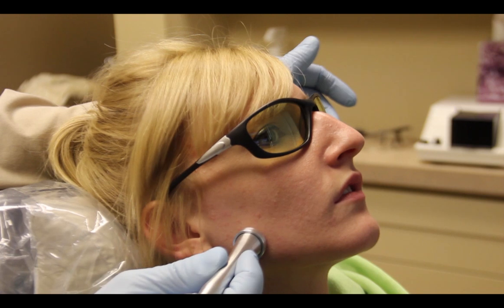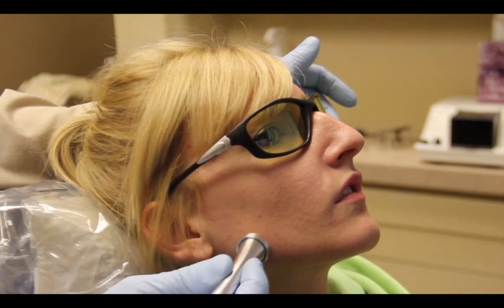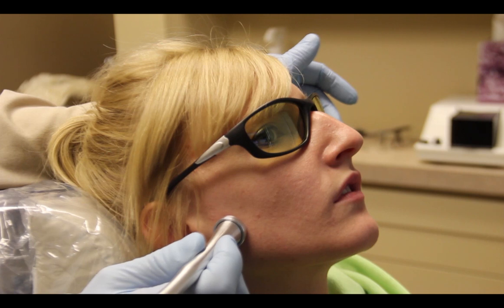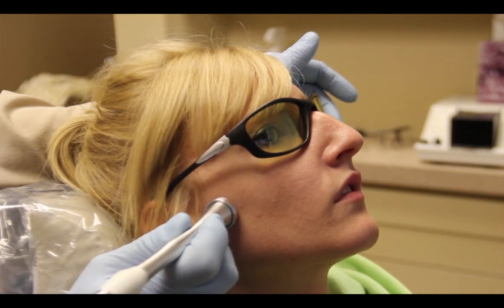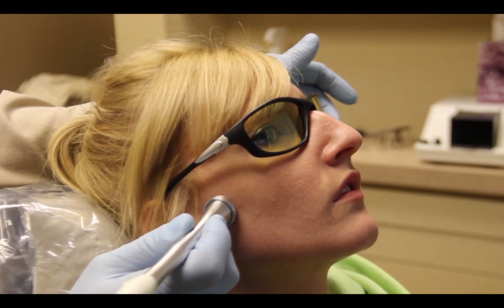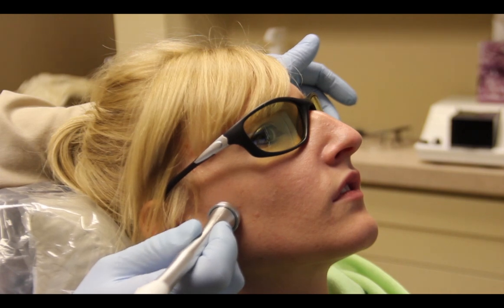Numerous people in this country have this type of pain, and this is a great adjunct to treating it. We're going to continue to go over the area. I like to go over the area for about three minutes on each side, going between the joint and into the muscular area, depending on what the patient is exhibiting as pain.